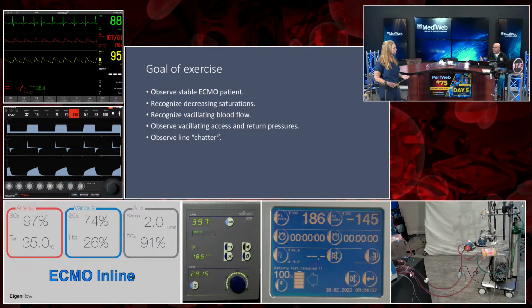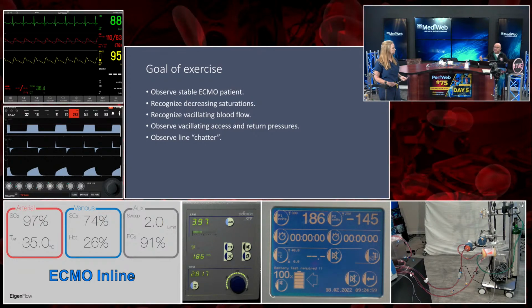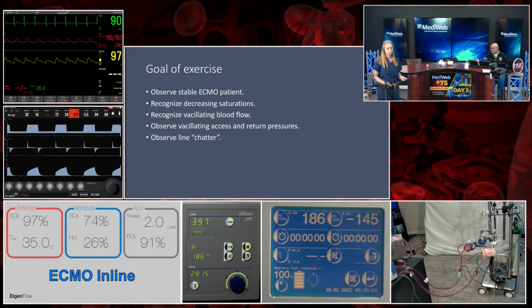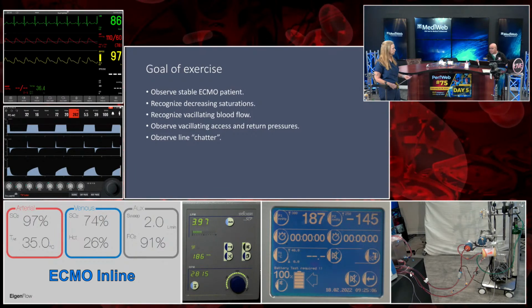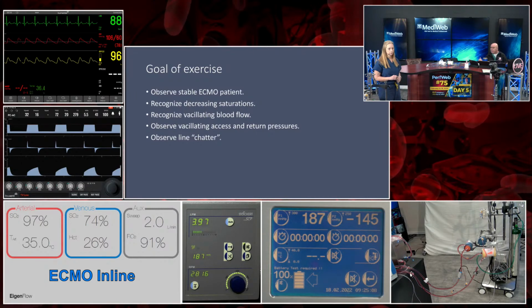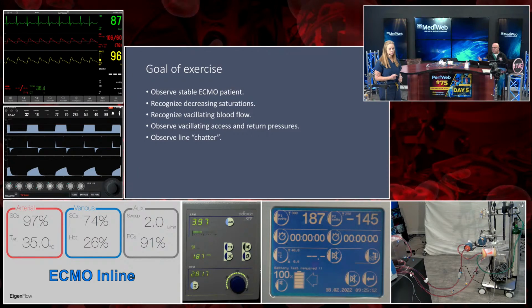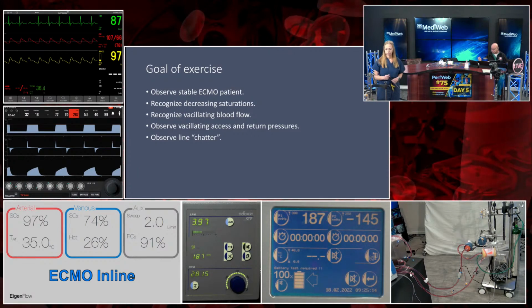You could try to make an adjustment to your vent, but your vent patient has very low compliance. Their volumes are 271. Their peak pressures are already 32. We're trying to get the vent turned down. They're at 70% FiO2, as you can see on the monitor. Bring the patient monitor up full screen, please.